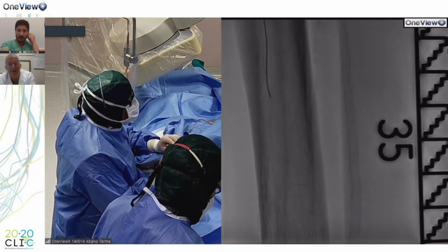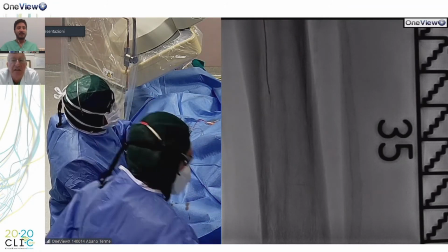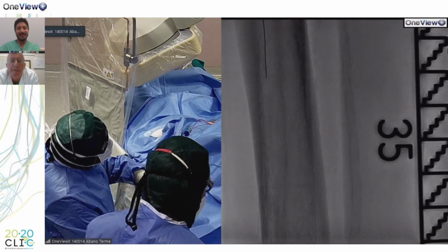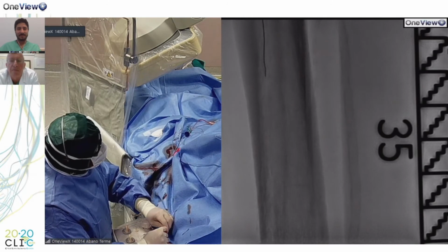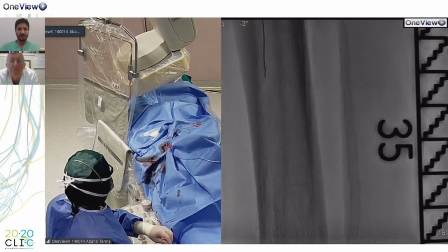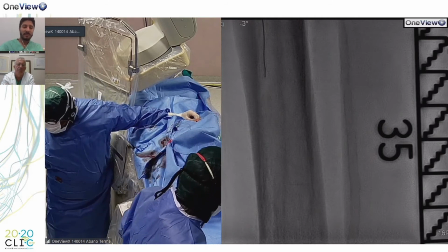Let me check. And Marco, maybe you can look at the calcium, but you can feel it by your hand, by the guide wire? Yes, of course. There is a resistance, and when you see the tip of the wire is going to lose the angle we shaped against the calcium, we prefer to avoid a loop. We don't want to create a loop now. I want to remain as much as possible in the true lumen.